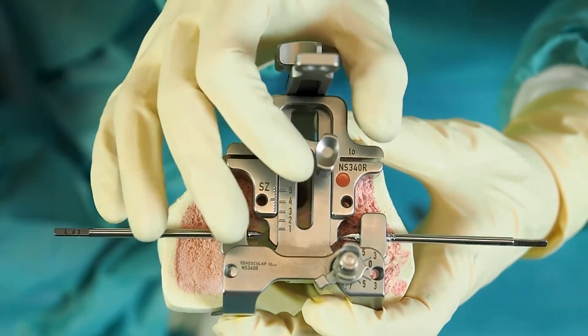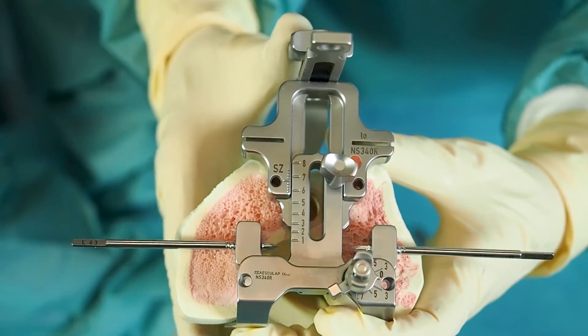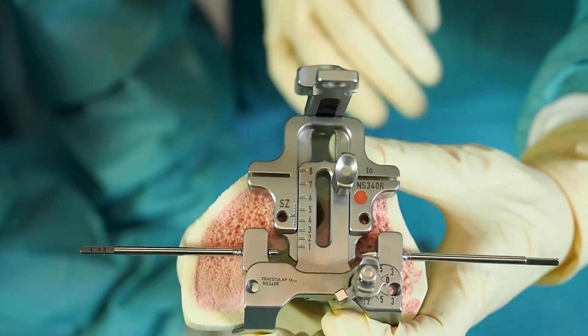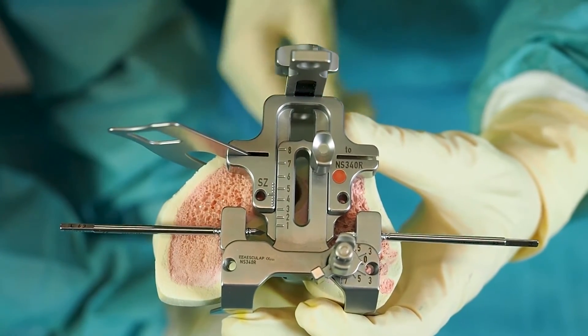In order to fix the AP size, the up screw can be tightened as soon as the tip of the stylus reaches the desired landmark on the anterior cortex. To check the anterior femur cut level, the cutting check blade is inserted in the guiding slots of the instrument.